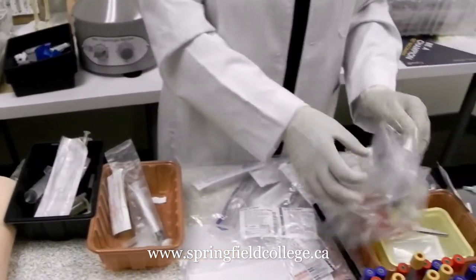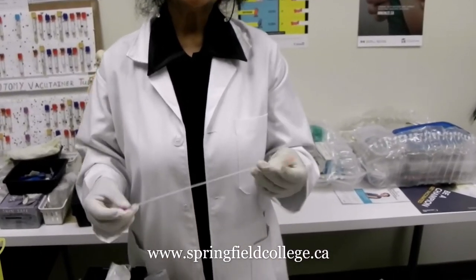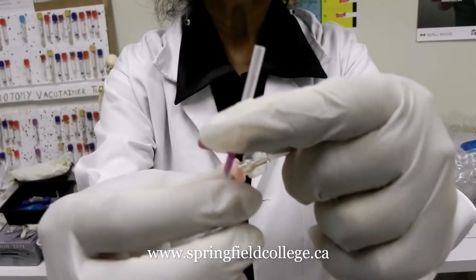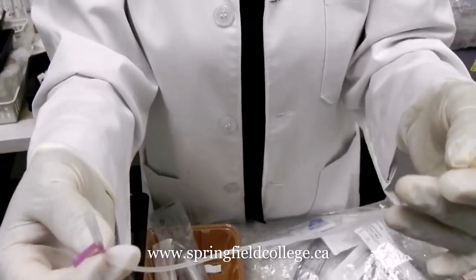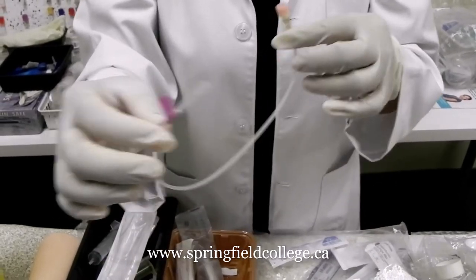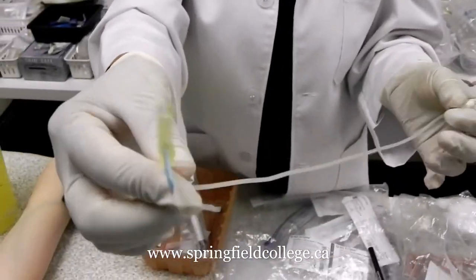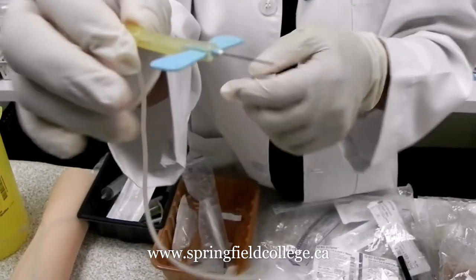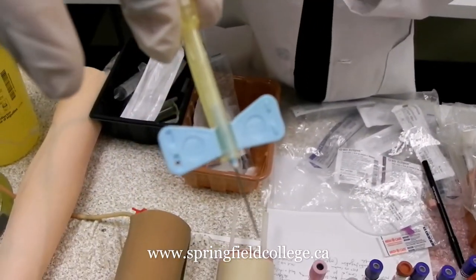We also use the butterfly. Sometimes we use it for collapsible type of veins, or for geriatric or pediatric patients, where we can use a very small type of butterfly. Different gauges come with different colors. As the number increases, the size decreases — an inverse relation. A 23 gauge needle for the butterfly is very commonly used, particularly when you are using it for the dorsal hand veins.